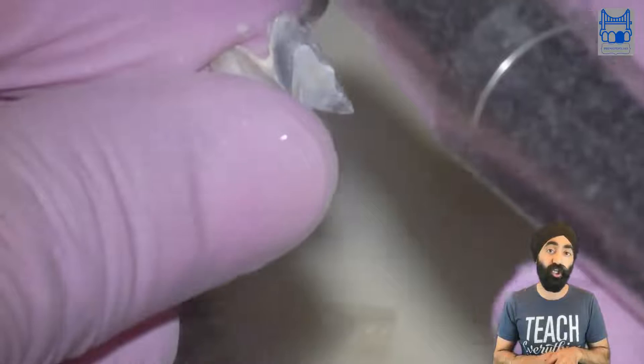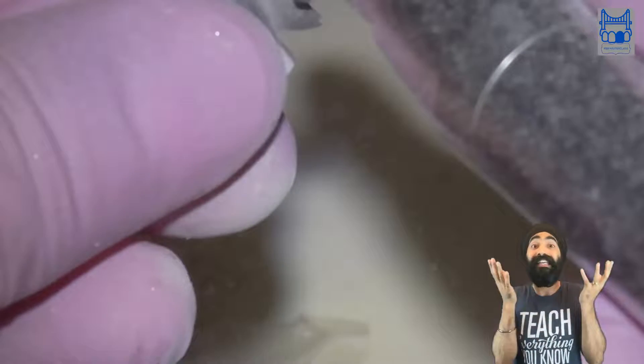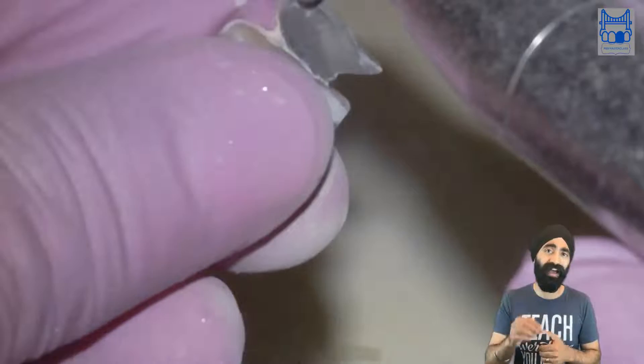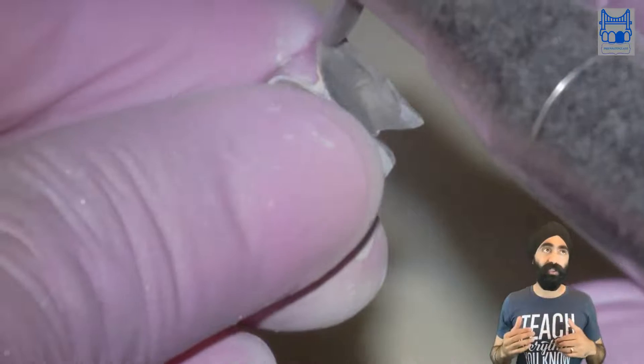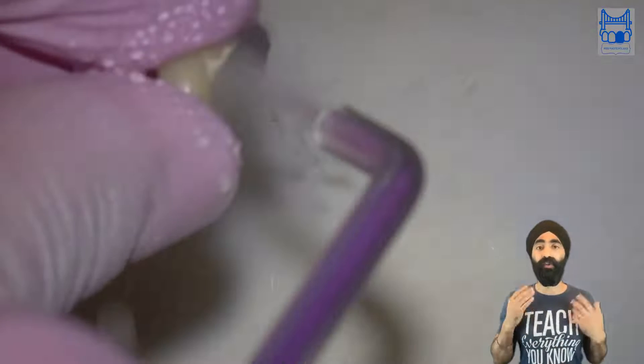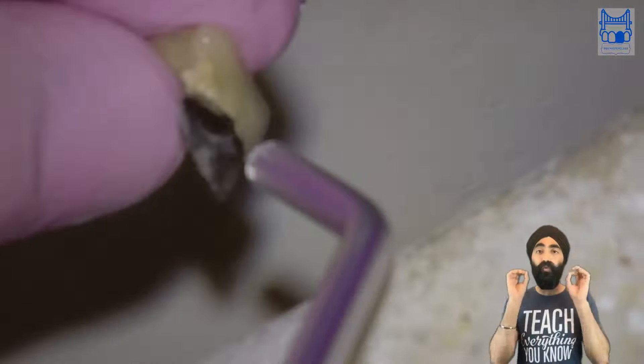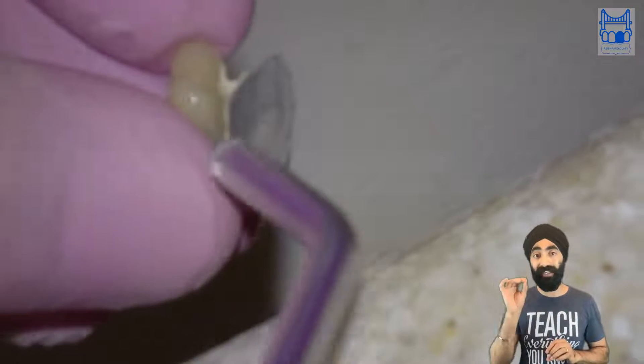Next is air abrasion of the resin bonded bridge — this is so important. Look how easily and nicely the cement got removed. What would you use instead if you didn't have this? An ultrasonic scaler? Diamond burrs? It doesn't make sense. So if you don't yet have an air abrasion unit, get one — very important. Now we have a really nice and clean resin bonded bridge ready to re-cement.